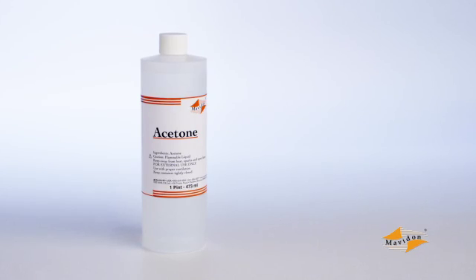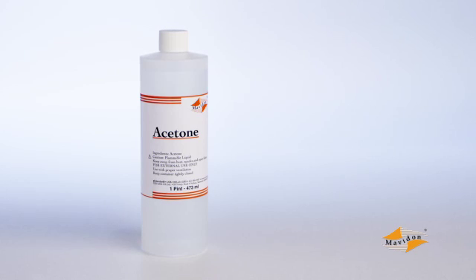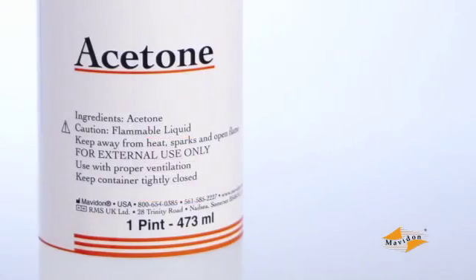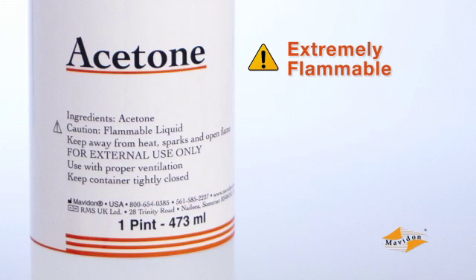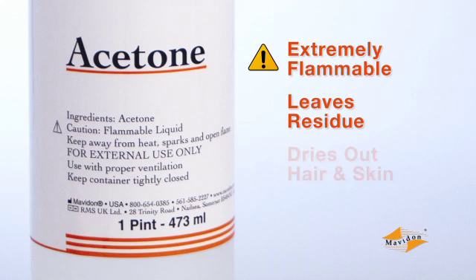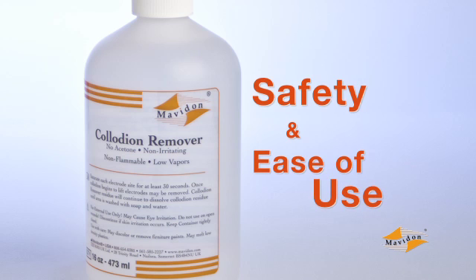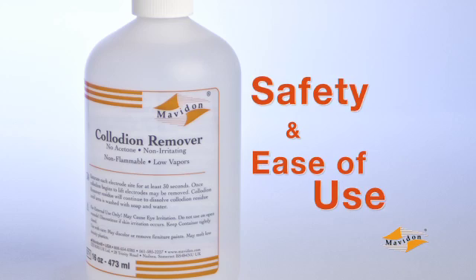Acetone is another common option for removing collodion. It is a strong solvent and can work faster than collodion remover, but it is very flammable, has a high evaporation rate which leaves a residue, can dry out the patient's hair and skin, and releases harmful fumes that must be vented from the room. For safety and ease of use, we recommend using collodion remover instead.